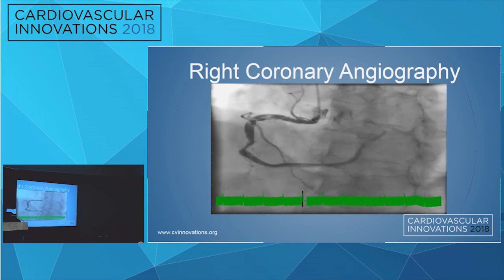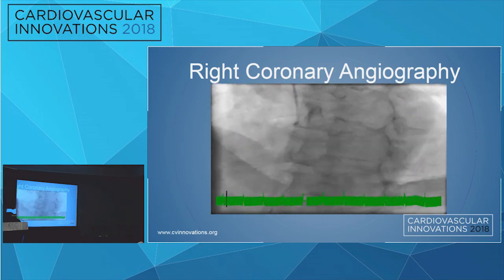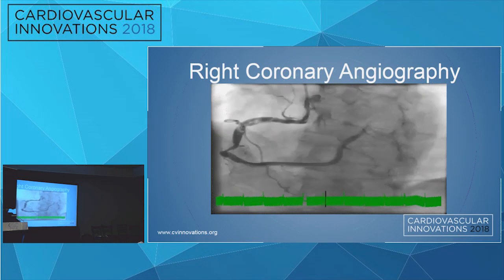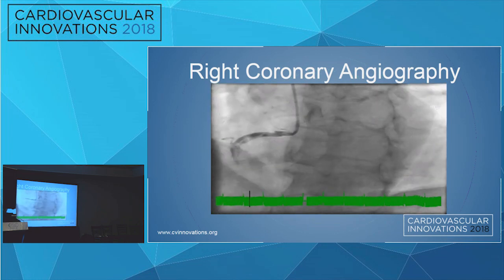I basically looked at this carefully, and I thought this could be a dissection related to her initial plaque rupture. I don't have any feeling that this was any sort of catheter-related dissection. Thinking, do I want to image this? Is it thrombus? There's a lot of different thoughts going through my mind, and maybe we can talk about this shortly.